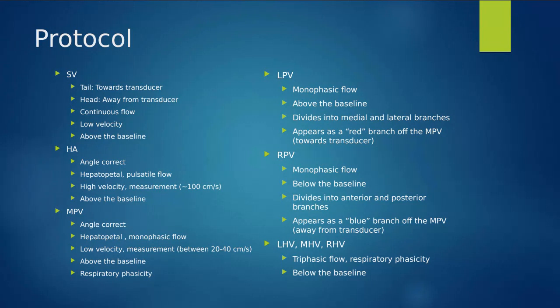Looks like we're coming in. We have a scale set to about 80, so rather appropriate. We can maybe come down a little bit more to occupy more space in that spectral window. It's important for us to know that when we are doing a hepatic artery, you have to measure the peak systolic velocity. That is what they are doing here with their caliper, and they are getting a value here. I'm assuming 50 something centimeters per second. Not the easiest read.